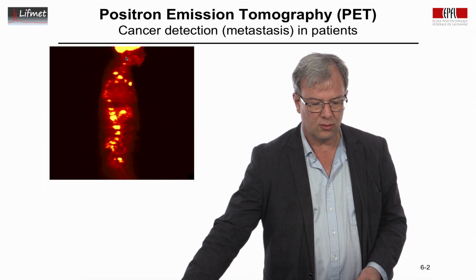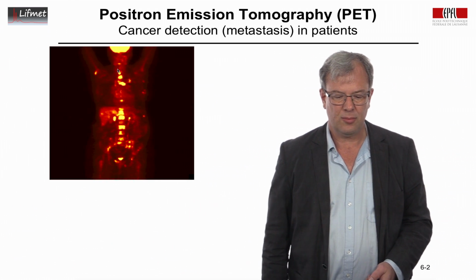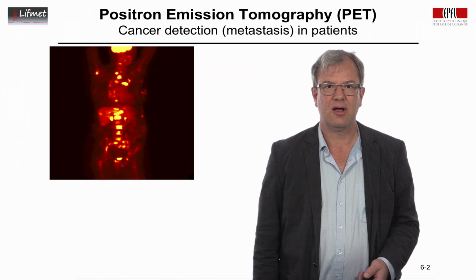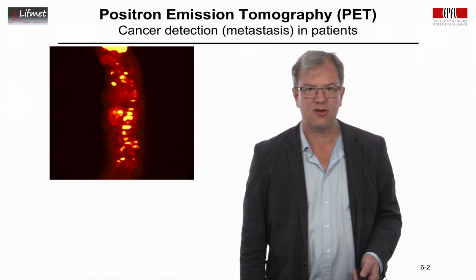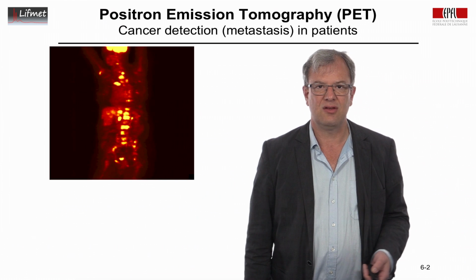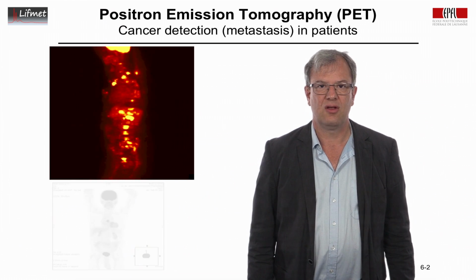We can see the whole subject. Here you can see the arms, and you see on the top very bright uptake in the head, and you see a lot of spots highlighted in the body. Those are metastases, and that actually in the clinical application has been a major motivation for this technique. This is the easy detection of metastasis in cancer patients.